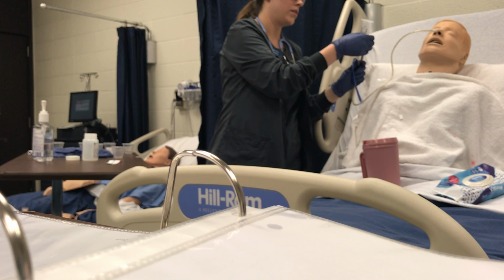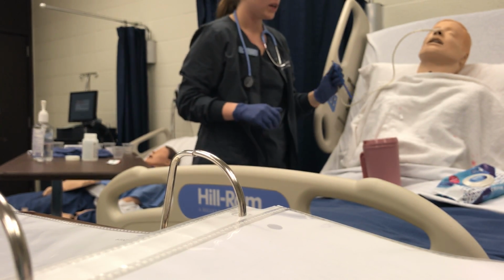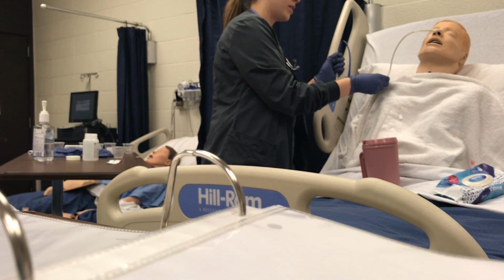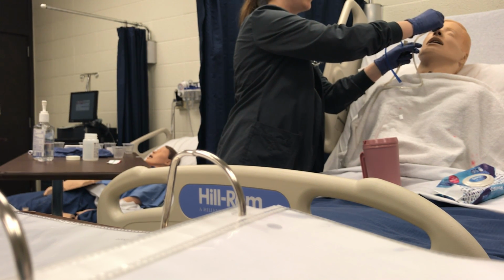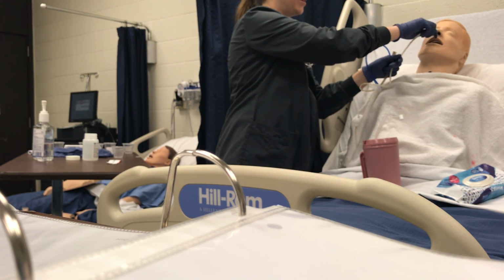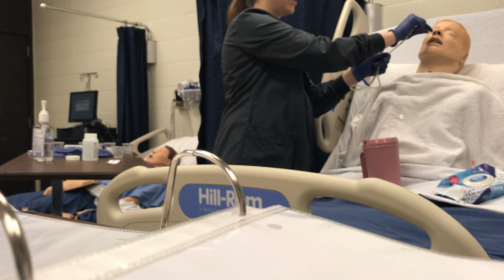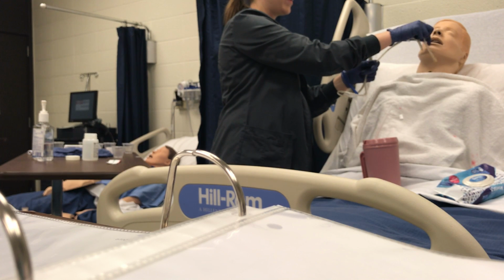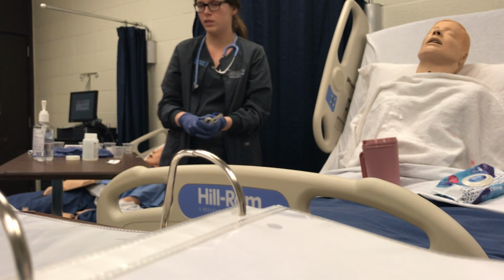Good. Okay, so now that it flushed well and it was good to go, I would unclamp the securing device here. I would also take the tape off his nose, and I would say take a deep breath. All right, we're going to pull it out in a twisting motion. Take it out, coiling it in my hand. All right, and it is all out and ready to be discarded.